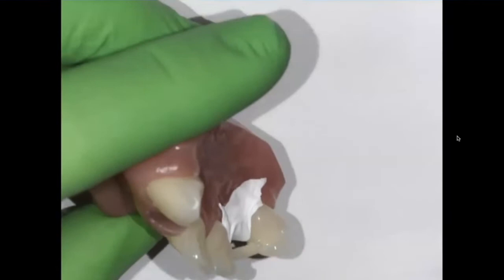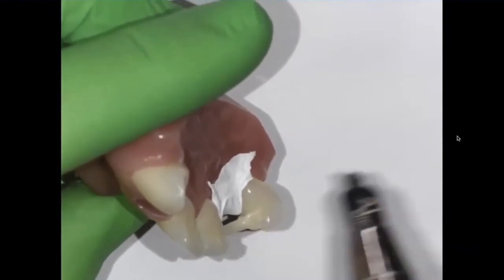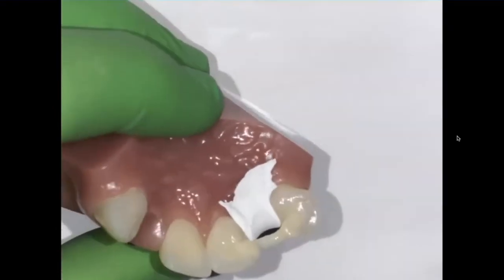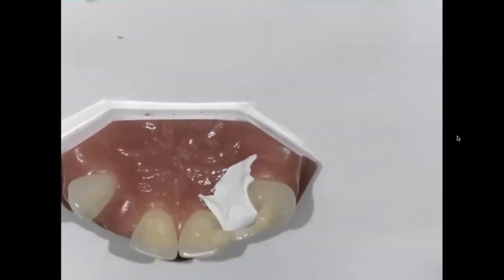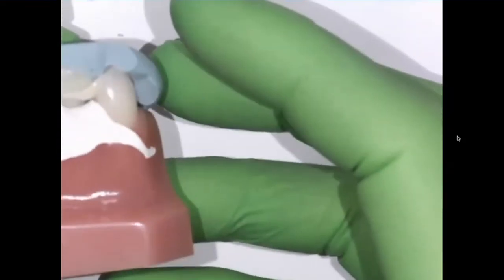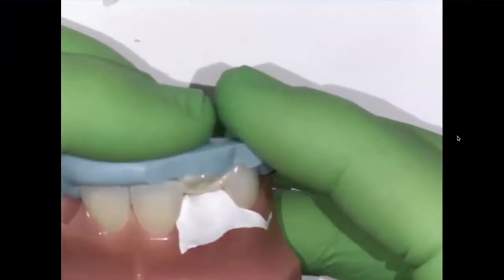So I'm going to come in with my hybrid composite, or I could use my nano fill — just run a little bit of material in there, a little material in there to make sure I seal that up. Then I'll take my putty matrix and bring it to the mouth.